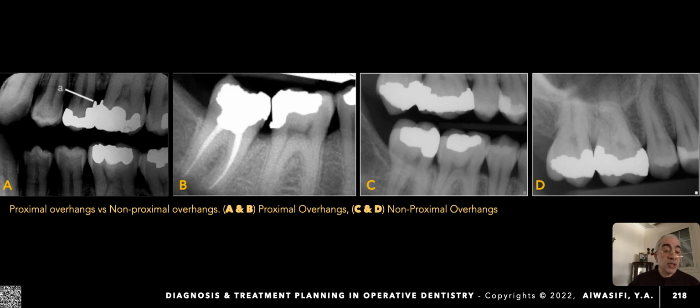You could note it between the upper second premolar and the upper first molar, and you could note it at figure B. It seems to have improper application of matrix, while in figures C and D you could note the accuracy of applying matrix and wedges, in the lower molar in figure C and in the upper molars in figure D. The condensation force adapts amalgam at the gingival floor, but at the same time never forces amalgam beyond the matrix you applied.